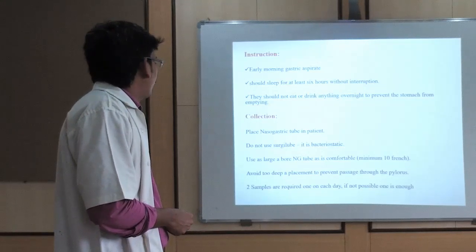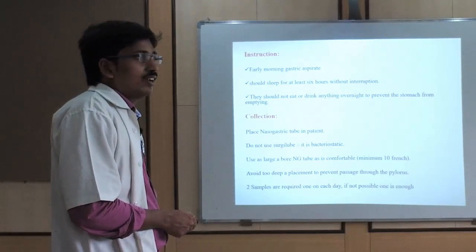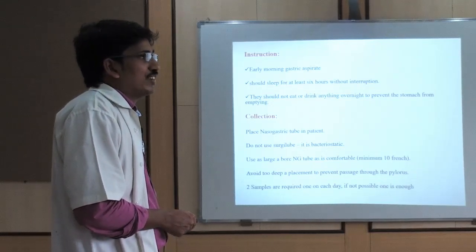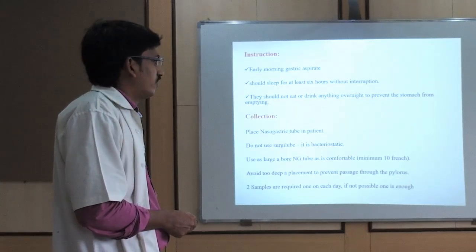Two samples are required for processing, one on each day. Suppose that is not possible, inform the respective microbiologist that the patient's condition is very difficult, so it is not possible to take two samples, and one is sufficient.